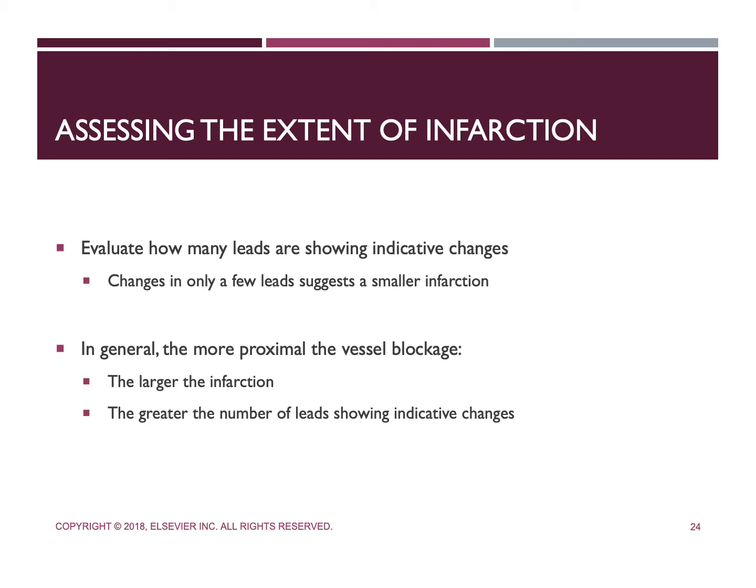It is also important to emphasize that the approach discussed here with regard to localization of an infarction, for example, determining which and how many coronary arteries are affected, works reasonably well for the STEMI.